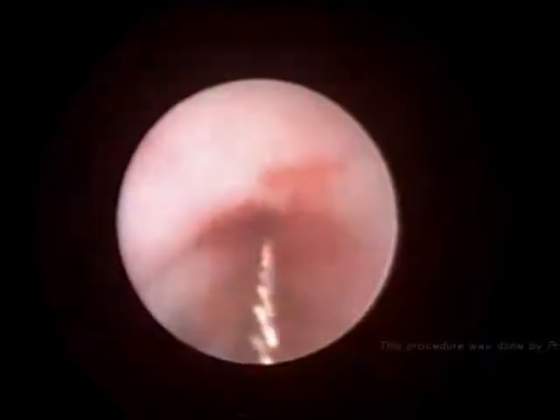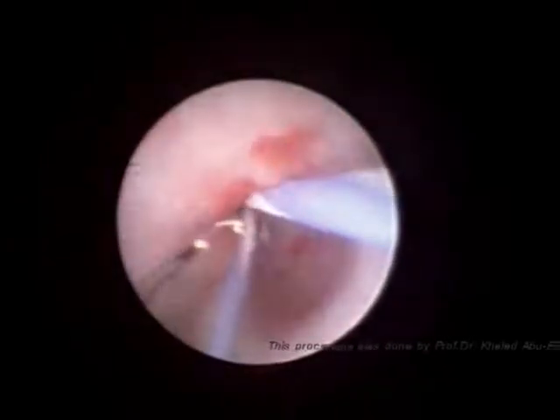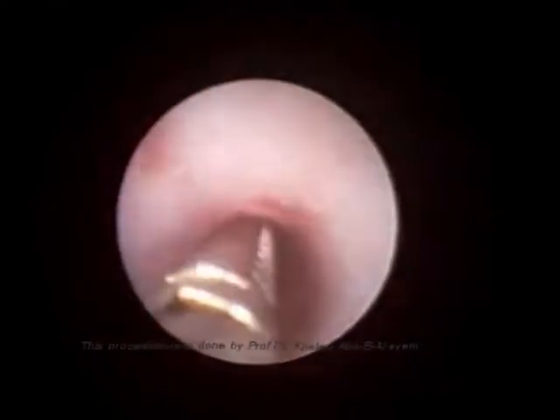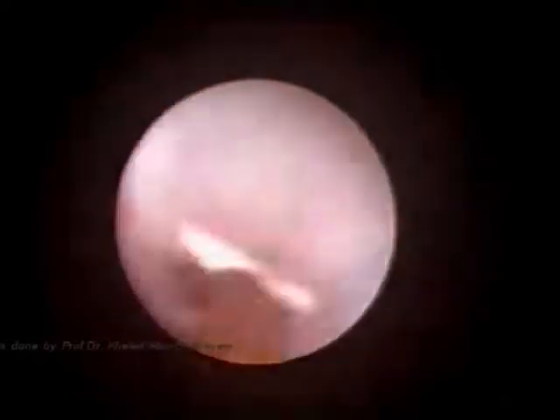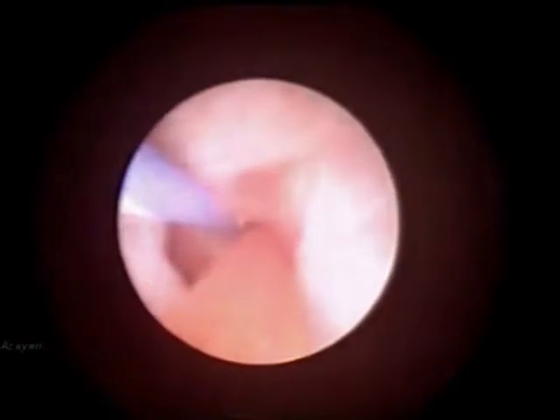Now this is the site of the stone, and this is the forceps — we are trying to grasp the stone with the forceps. You can see the stone here, but it is difficult to pull the stone because of the stricture site below the stone. Now this is the dormia basket and we are trying to grasp the stone with it, preventing the stone from migrating up while we are fulgrating.